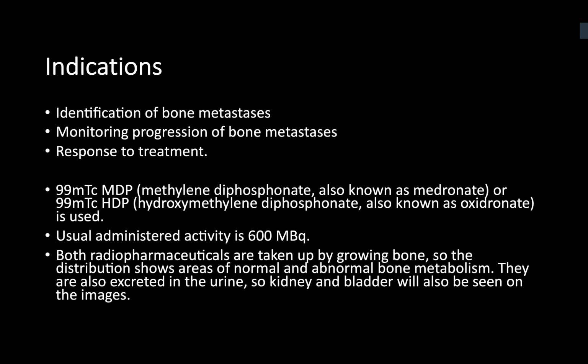All right. What are the uses of bone scan in prostate cancer scenario? So the uses could be in the initial staging of the patient, or it could also be for follow-up for patients who are already known metastatic from diagnosis, to see how much they've responded to treatment. Okay, well done. And what's the radionuclide used in bone scan? So it's a metastable technetium-99 labeled bone scan.